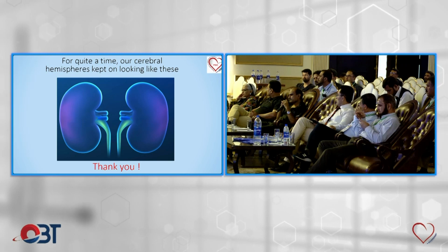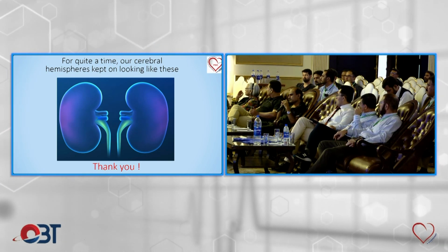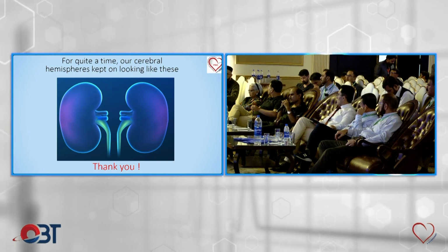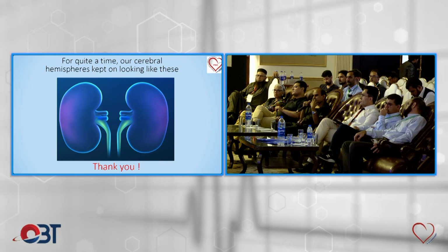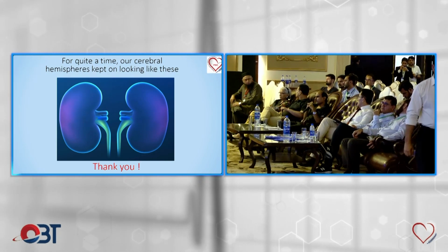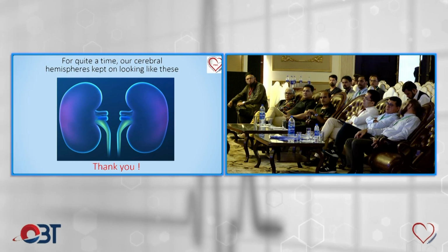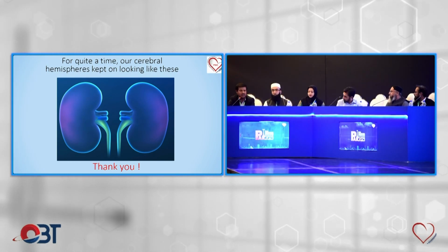But personally, I agree with your comment. My preference for CKD patients is again femoral, and the distal radial can be one of the options. Because another teaching is that from femoral access, you can easily engage the guide catheter and manipulate your hard wires very easily.